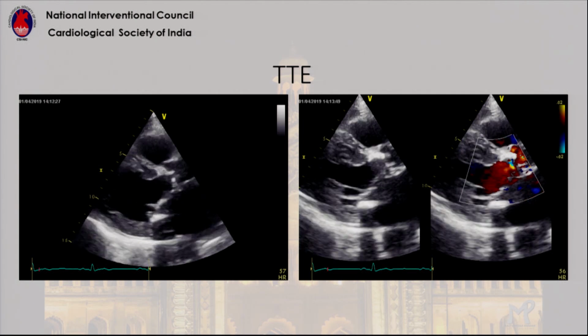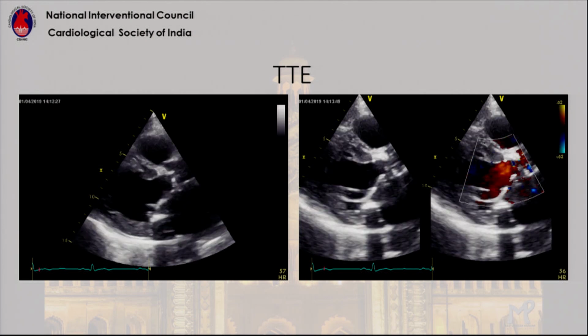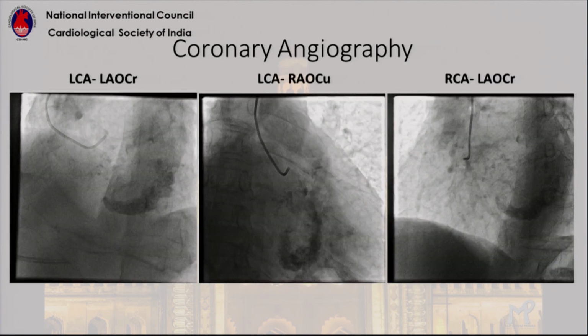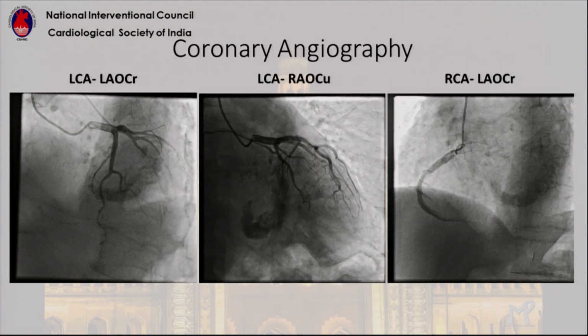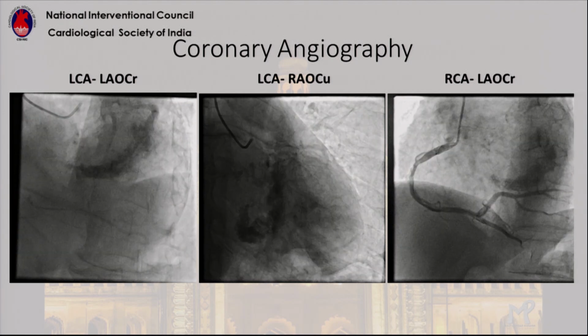So that's the echo you see. He has aortic valve calcification and it's severe aortic stenosis. You see some leak there, and there is a heavy mitral annular calcification. You can see on the posterior end of the mitral valve, there's MAC in there. That's the gradient shown. Next, please. So that's the amount of MAC. There's very heavy MAC actually. The coronaries are okay.